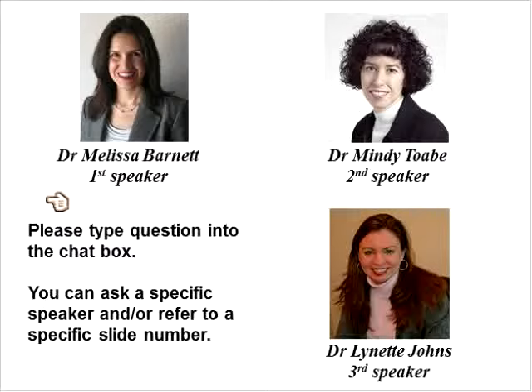So here's another good question. This is directed to Dr. Barnett. You had a photograph and you mentioned the large cases for the hydrogen peroxide systems. The question is, what do you do about the neutralizing disc? Well, from the dry eye shop, it does not come with the neutralizing disc, so I guess you would purchase the ClearCare and that with the large case.